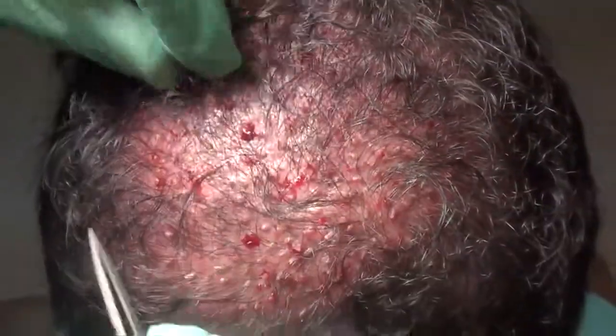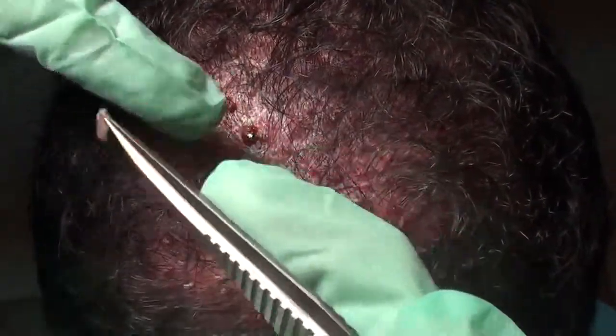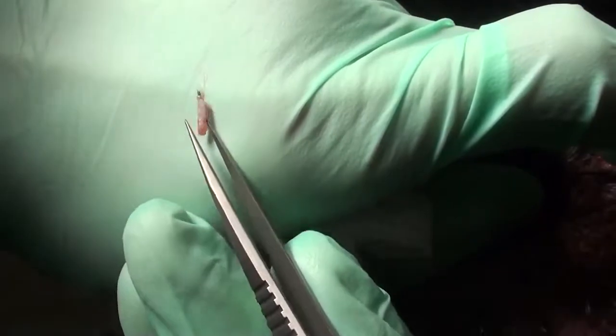If you want to kind of get a feel for what a graft looks like, let's take one of these guys out. Okay. So here's a graft that just came out. These little black dots are the bulb of the follicle. If you look at it from the top, you can see there's about 2 or 3 follicular units in it, and each little separate dot's a hair. 1, 2, 3, 4, 5, 6, 7, 8 hairs in that one particular graft.